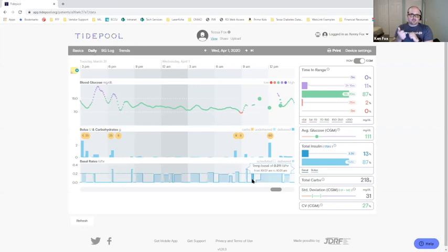So once it changes to something else, then it would log how much was delivered with that basal rate for the last 5, 10, 15 minutes. Does that help? If you really want to know, you've got to go into Apple Health and look at it. I don't know where you could find in a 5 or 10 minute block how much insulin was really delivered, other than doing the math by looking at the insulin on board.